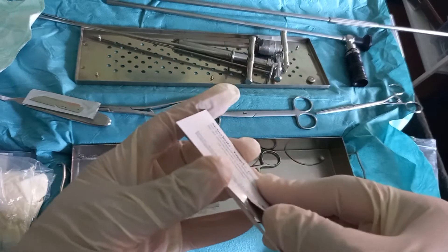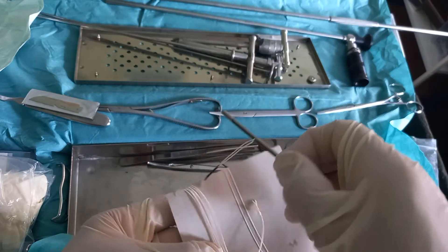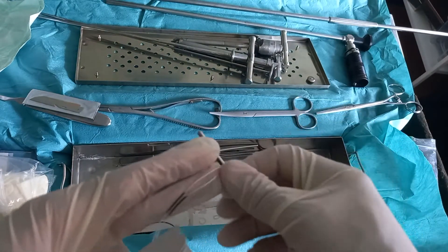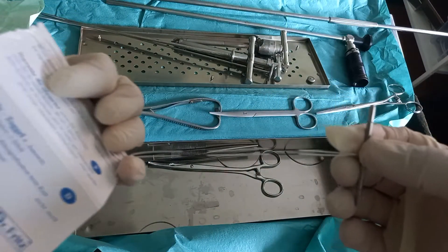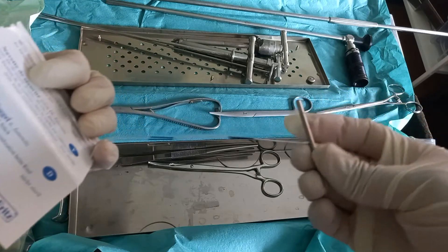As we can see there are two black points on the toggle, and they will be used as a guide later on during the operation.